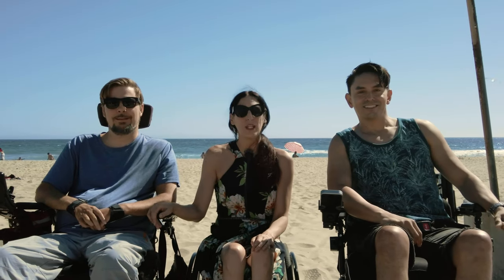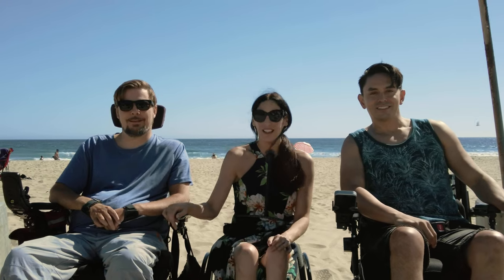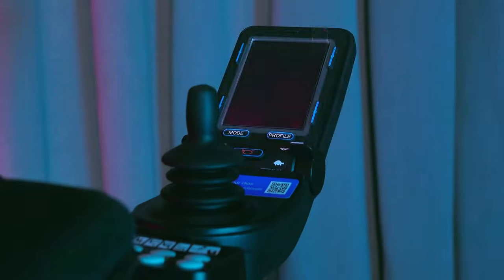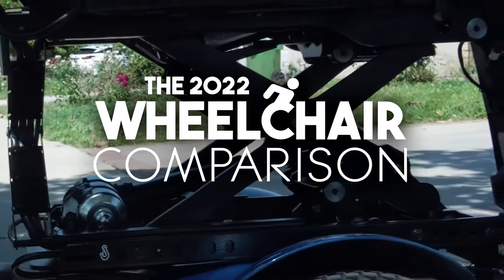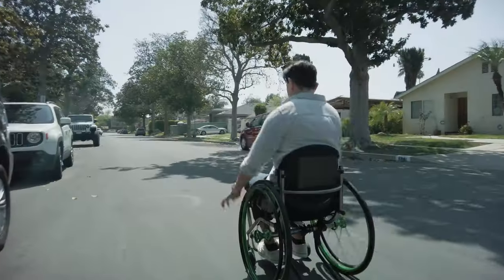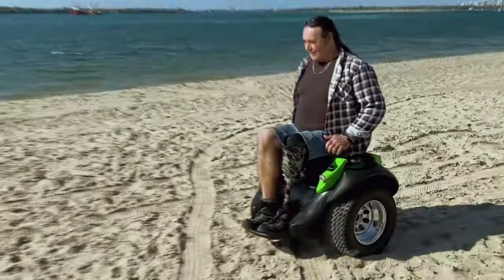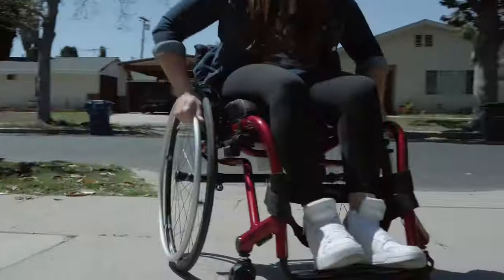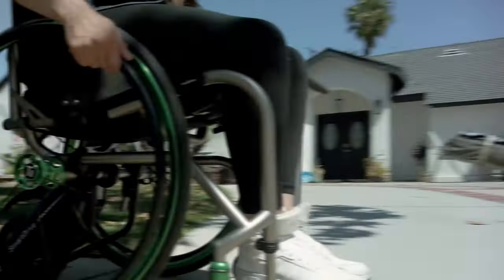Welcome to the 2022 Wheelchair Comparison, brought to you by the Christopher and Dana Reeve Foundation and Gold Pictures. We're going to show the features of each chair individually, and then compare them all in the final episode, so stay tuned.